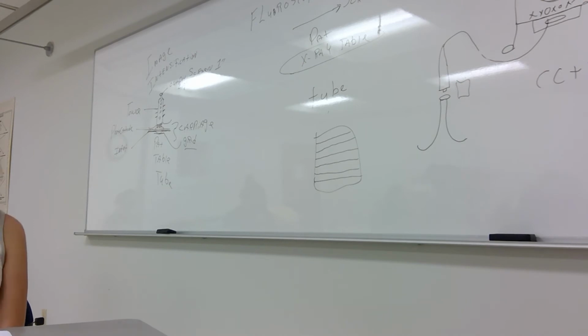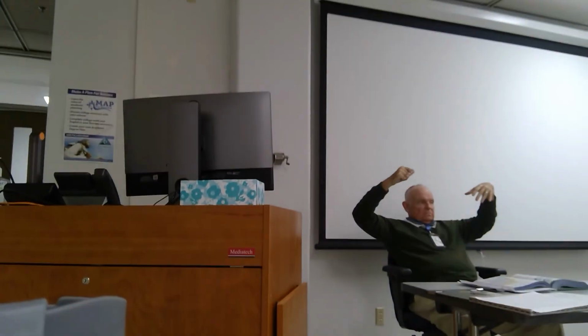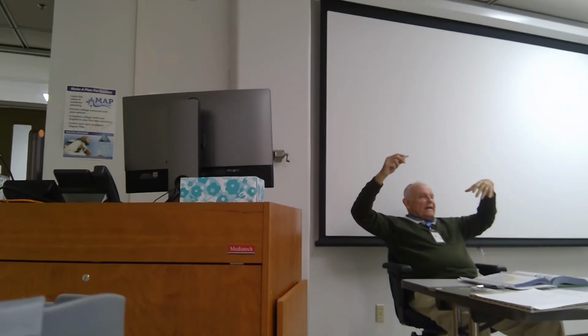Now, they have what they call remote image intensification rooms, where you can make everything work from behind the control panel. Where would that not work?